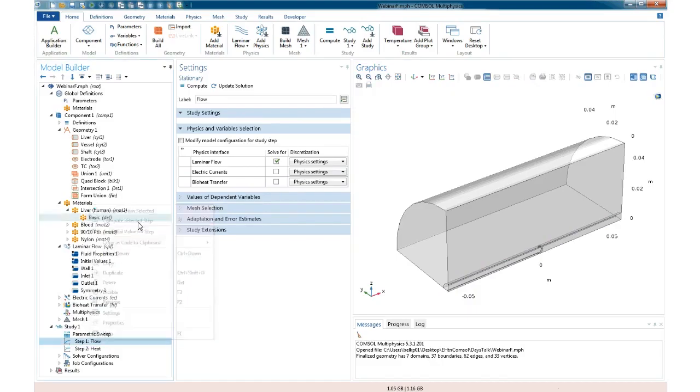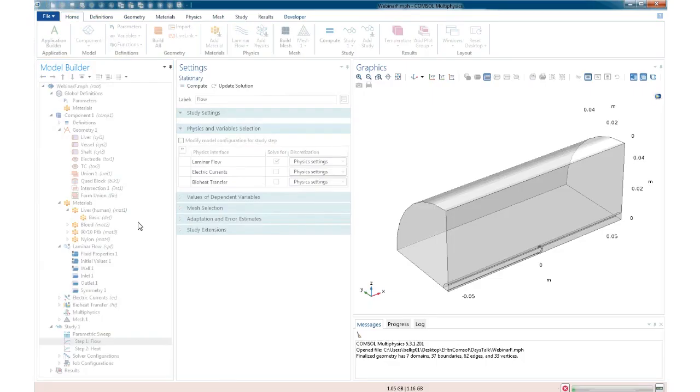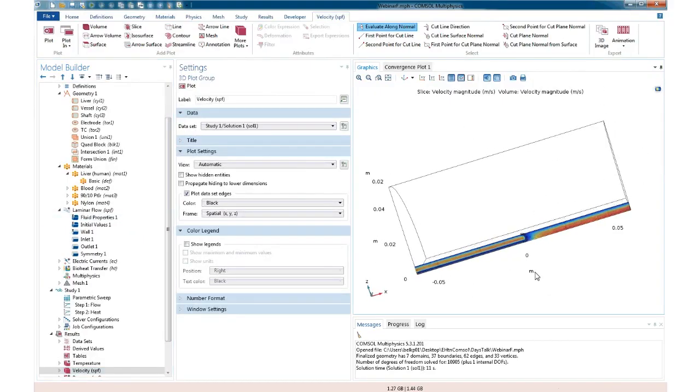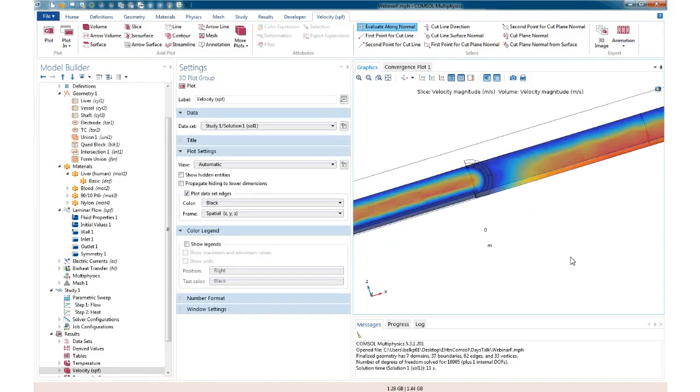And with any luck at all, okay. So it's given us a plot, and we'll go in and check that this all makes sense. And of course it does. It's laminar flow. We've got slow near the edges, we've got fast near the center, and this electrode is disturbing our flow as it should be, and as will contribute to our results later on. So great, that worked well. Now we need to put in the heating. The heating is through electric currents.